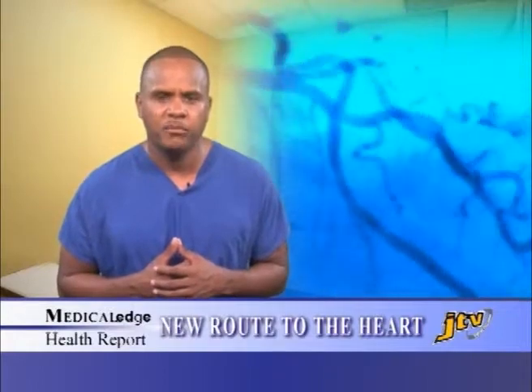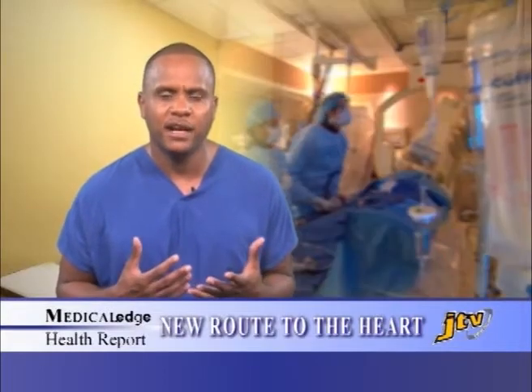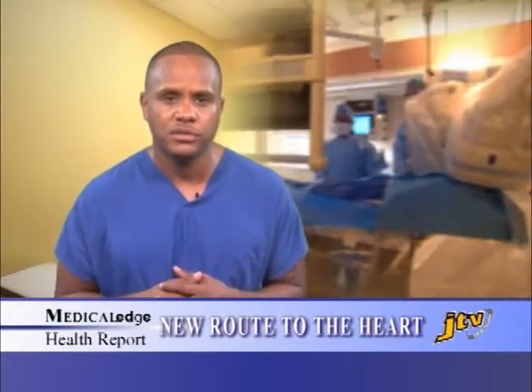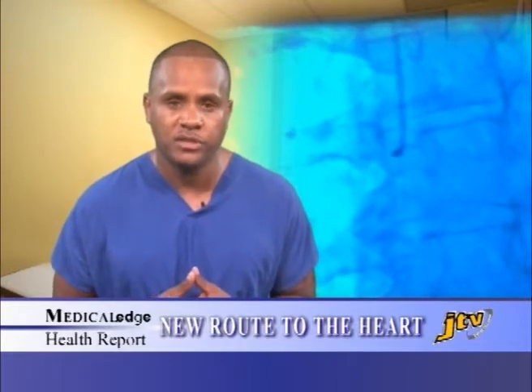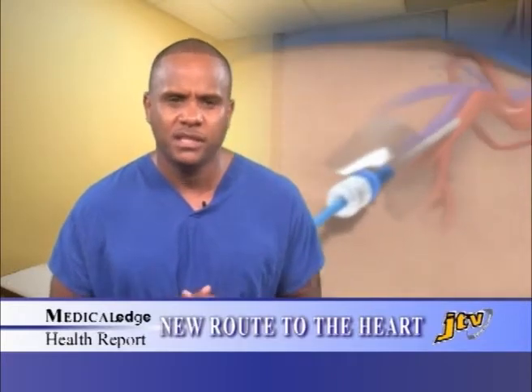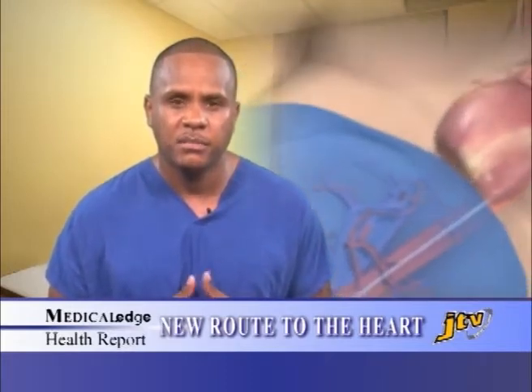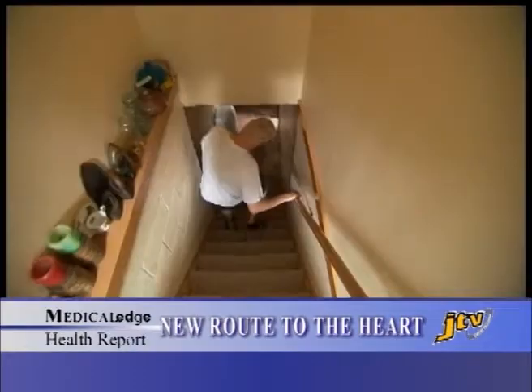Every year, thousands of people have cardiac catheterizations or angioplasties. That's when a doctor threads a catheter to the heart arteries to look for blockages and other issues. If they do see a blockage, they can decide if placing a stent to open it would be beneficial. For years, doctors have used the artery near your groin as an access point for this procedure. But now some are using the artery in your wrist. Why? Because it may be safer and easier on patients.